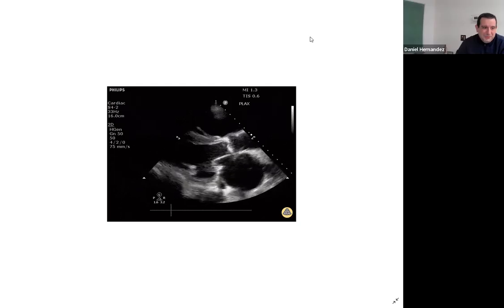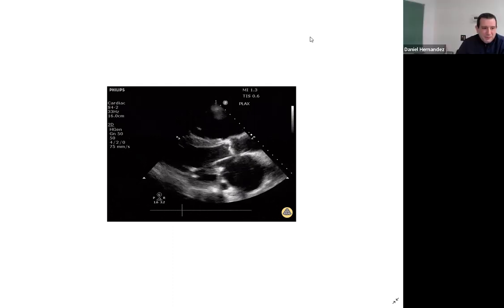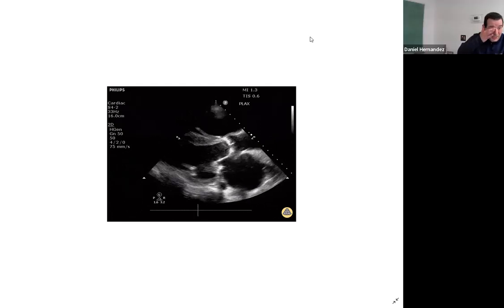Yeah, at the bottom. You see what I'm talking about? You might be picking up a cord or trabeculation, but it looks huge, right? It's big. Shouldn't be that big. That's a big dilated RV. We typically only see a small little segment. We're seeing a big RV on this guy.